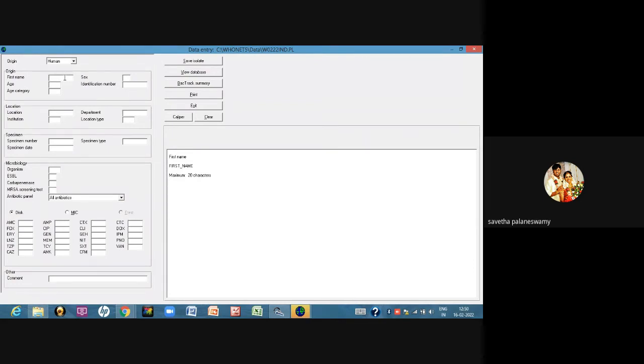Okay. Patient name is Velappan. Male. 70.